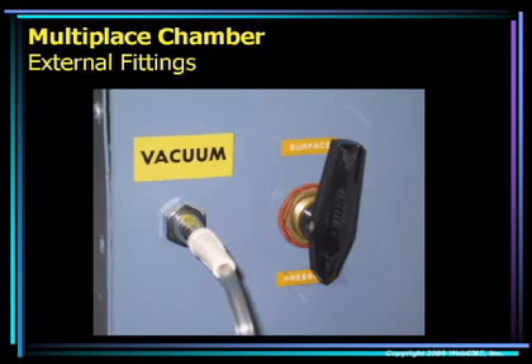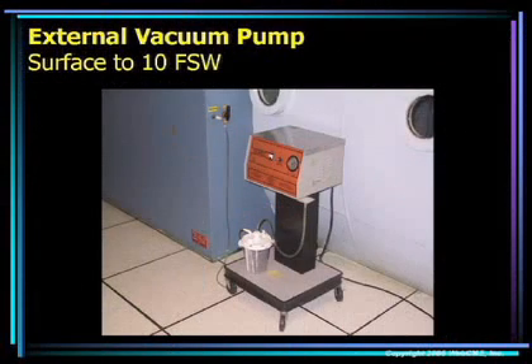This is the three-way valve on the exterior of the multi-place chamber, currently in the pressure setting — meaning we are deriving our suction from the pressure gradient across the chamber hull. When the valve is rotated 180 degrees to the surface position, we need to turn on a GOMCO suction device to provide vacuum when the chamber is at surface pressure. This is the GOMCO pump located outside our multi-place chamber. This pump is turned on and connected to the three-way valve any time the chamber is at less than ten feet of seawater pressure.